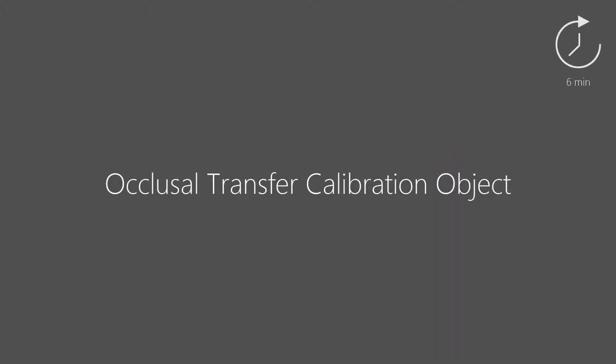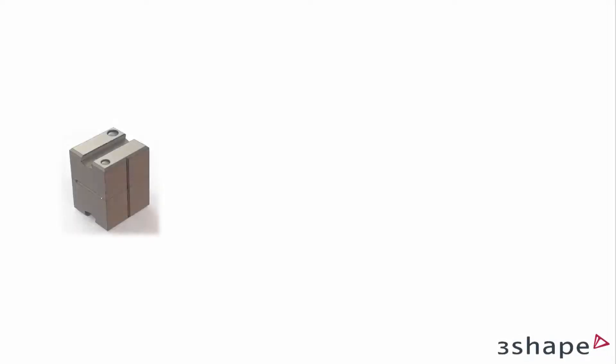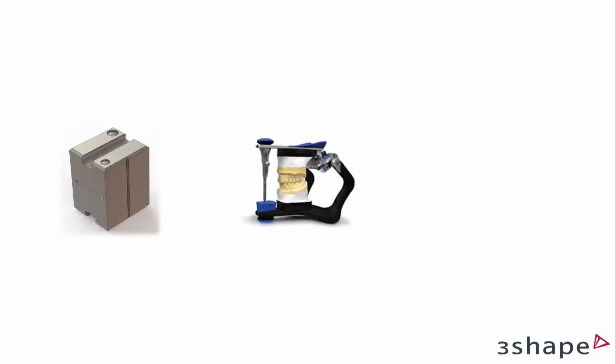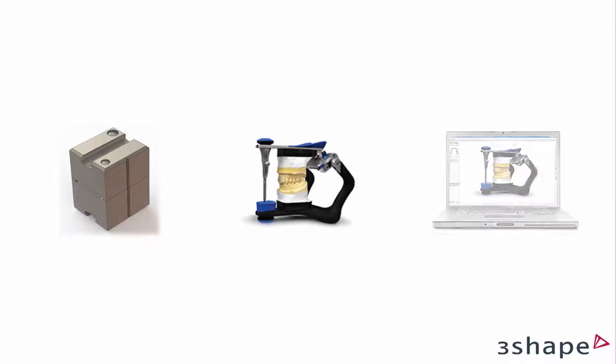In this video you will learn how to use the Occlusal Transfer Calibration object. The Occlusal Transfer Calibration object is used for calibrating the position of mounted models from a physical articulator to a virtual articulator.